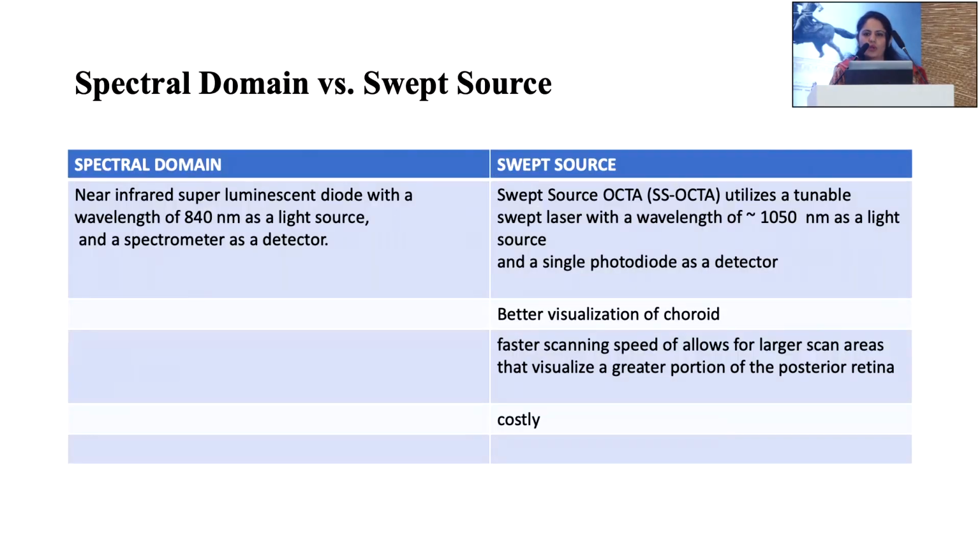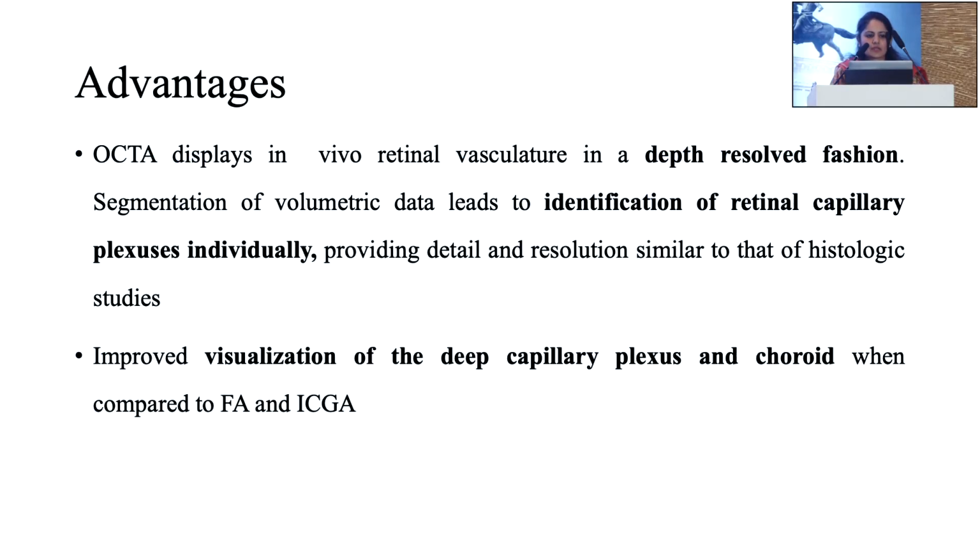As we all know, there are different OCT technologies: time domain, spectral domain, and swept source. Swept source is the latest. It has a longer wavelength, so more penetration and better choroidal view. But the thing is that it is costly.